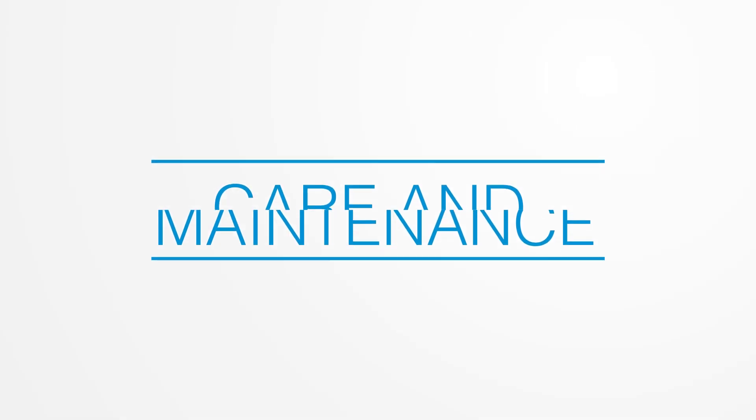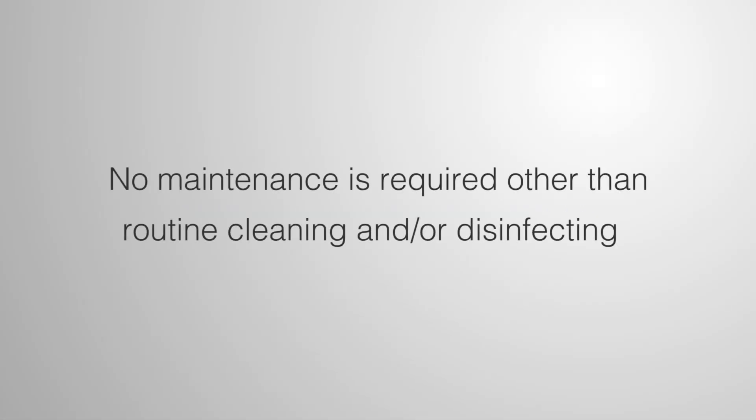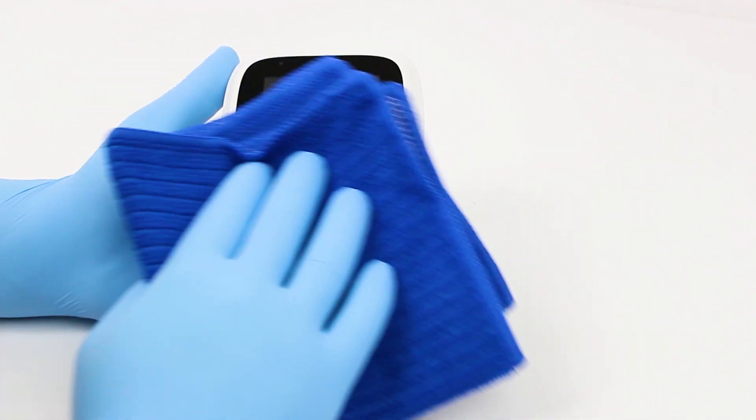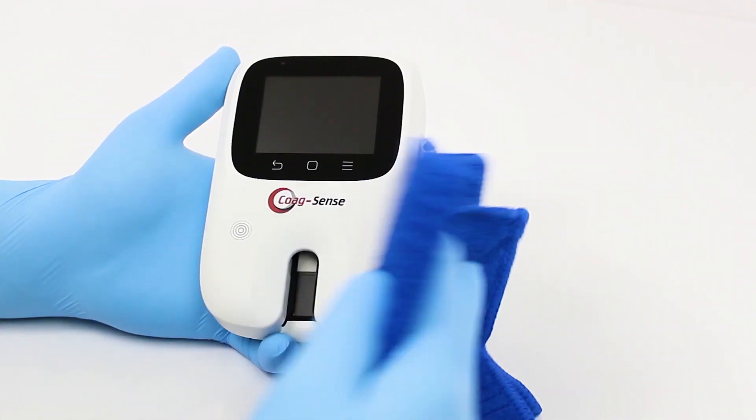Care and Maintenance. No maintenance is required other than routine cleaning and/or disinfecting. When the power is off and the USB cable is not connected, the meter housing can be cleaned and disinfected.